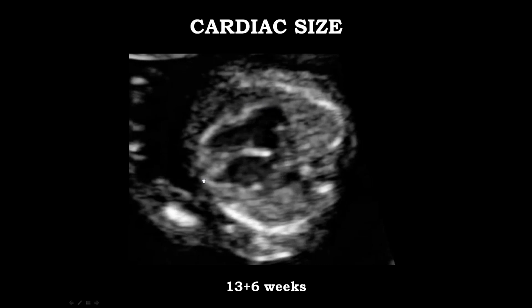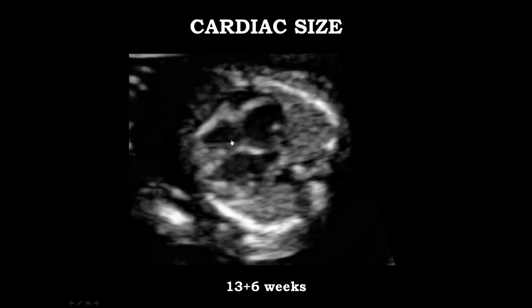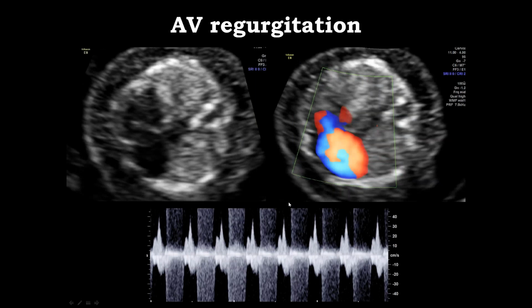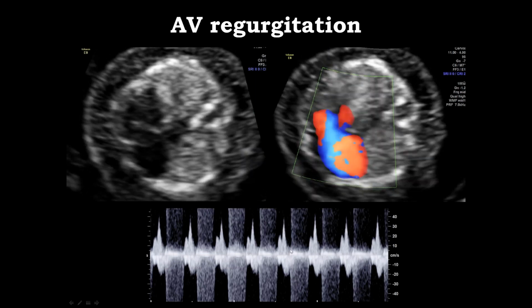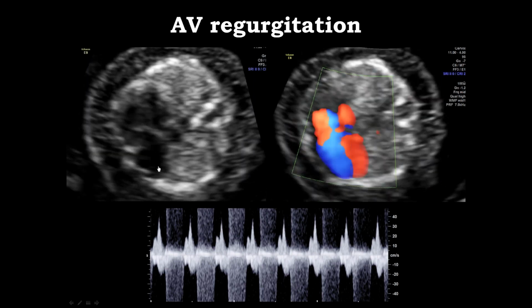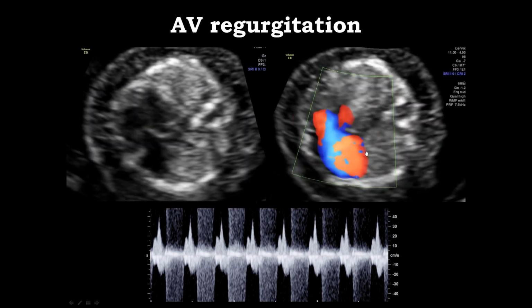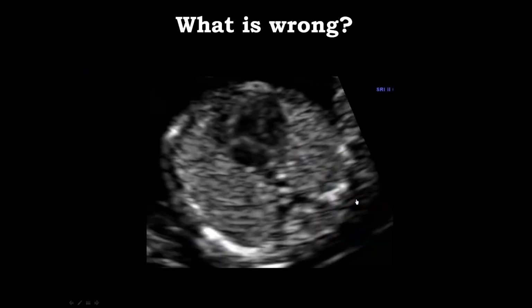So this heart is enlarged, and we can see here that the largest part of this heart is the right atrium. And even without applying color Doppler, most of the time the reason for that is the presence of tricuspid insufficiency. And this is this situation. It's a different fetus where we have significant insufficiency on the color Doppler and holosystolic tricuspid regurgitation confirmed by the spectral Doppler. And usually the very significant cardiomegaly and significant tricuspid regurgitation seen in early gestation have a very poor prognostic outcome. But the situation is not that clear all the time.